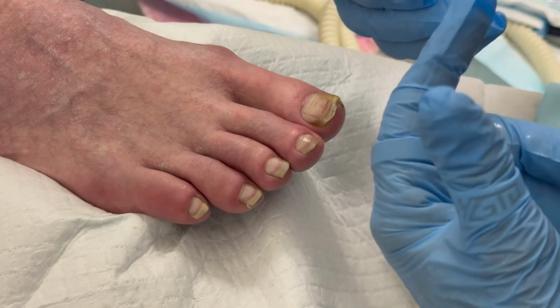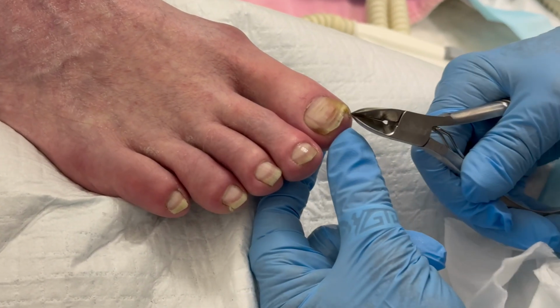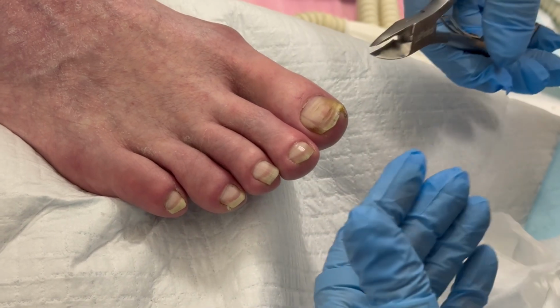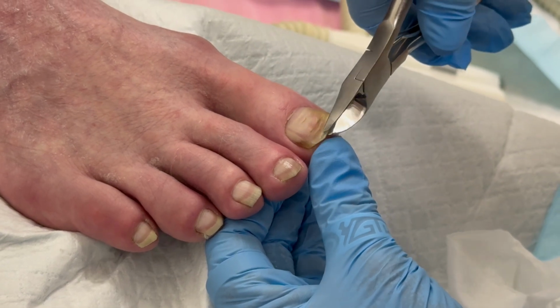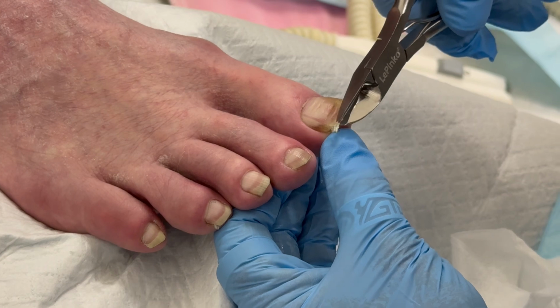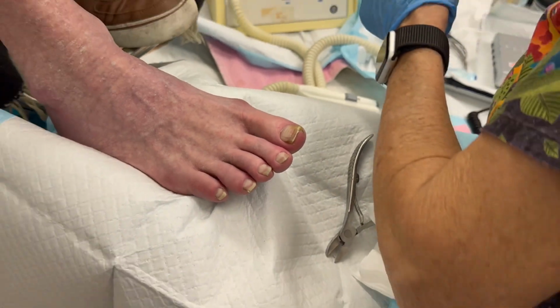So what I'm going to do is take off a little bit of the length of the toenails. If there is free border, which means there's actually toenail hanging over and not attached to the toe, I can clip it and get off a little length with that. And just for fun here, you take little nips across there.